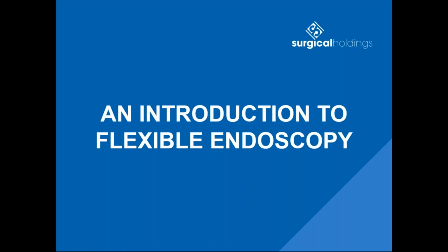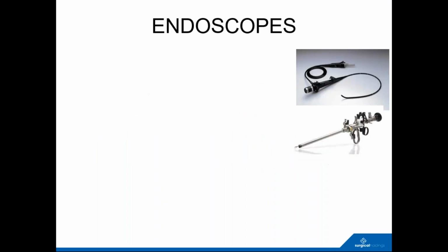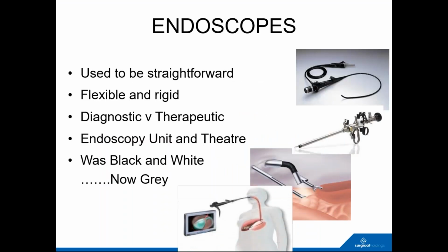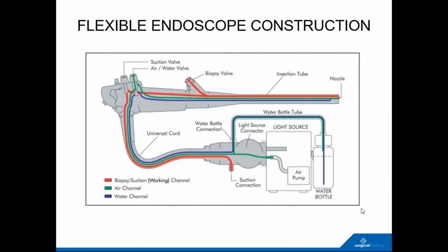Got a question from Claire just come in. If only air and water go down the channels, how do they actually become blocked? Well, at the tip, you can see that these two join, and you may get some material in here that will stop it. So you'll block it usually here. Ingress of bodily fluid, shall we say.